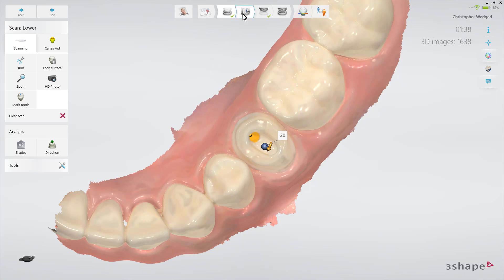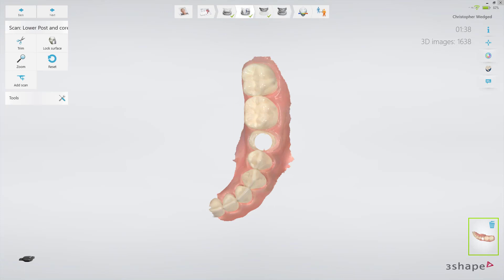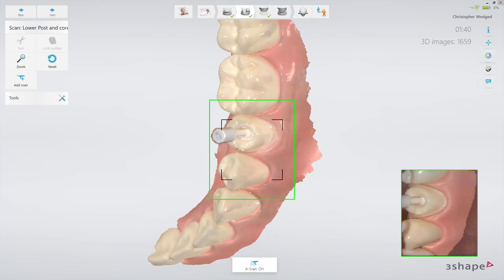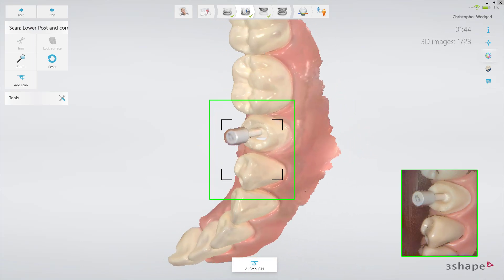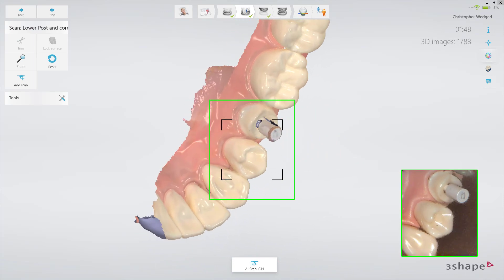Now proceed to the scan post and core page. Insert the scan post in the prepared canal and start the scanner, pointing at a neighboring tooth. Once the scanner has picked up the position, slowly move to the scan post and circle around it to scan it from all angles.